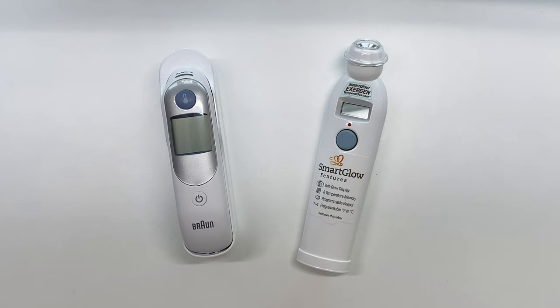I would highly recommend you get something from a reputable company. I know Exergen sells directly to doctors — they have thermometers that are upwards of hundreds of dollars, and even my doctor's office uses an Exergen.